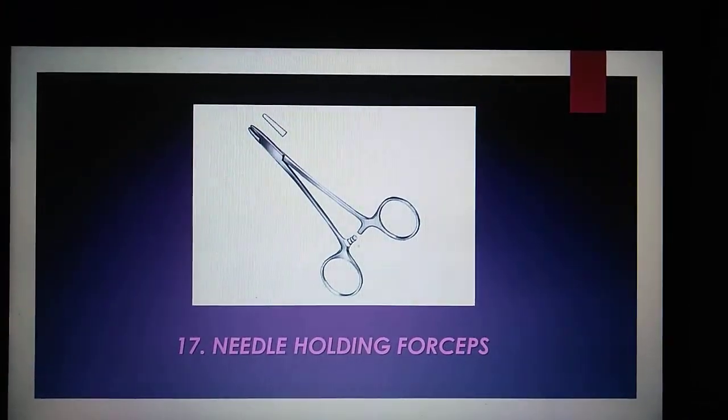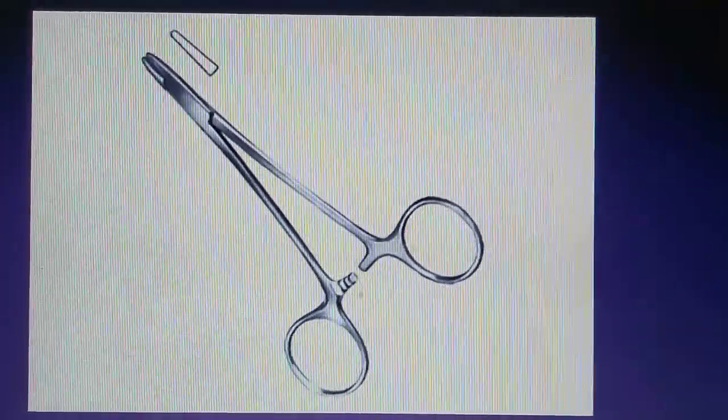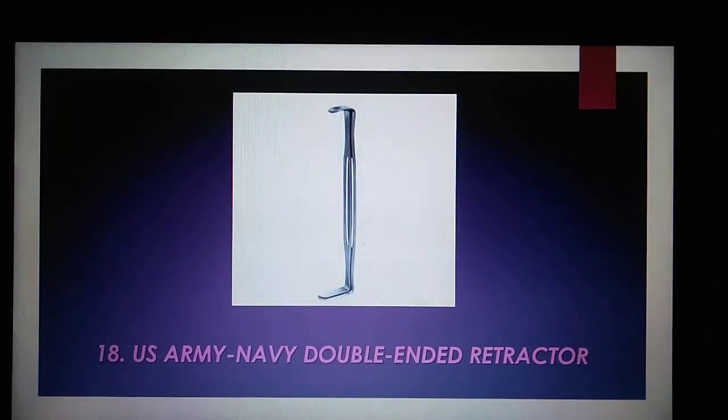Needle holding forceps are used with small needles and fine suture material, commonly in plastic surgery or subcutaneous procedures. The U.S. Army Navy double-ended retractor is commonly utilized to retract incisions that are small or shallow.